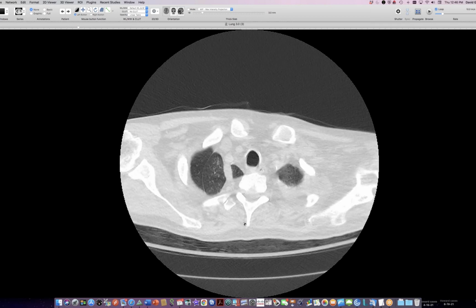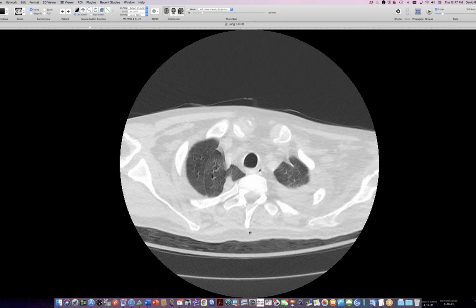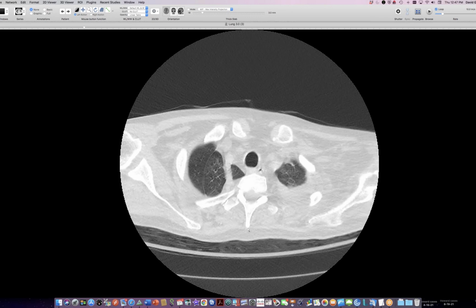One was after pneumothorax, and one was after, I think, VATS, where they dropped the lung, and I think it just pops out. But the ones I've seen, the fissure stays in its place. I don't know. I think it's been reported spontaneously too. Okay. Maybe during growth, as the patient grows and the lung grows, maybe it pops out slowly.